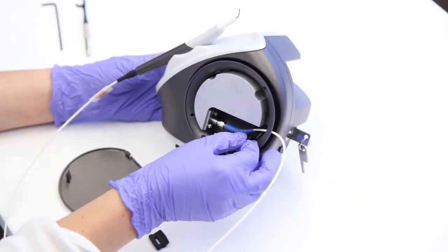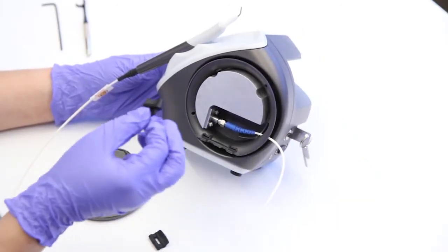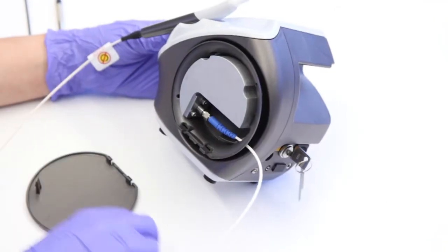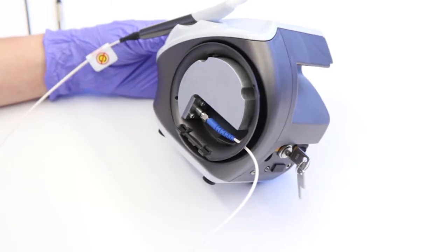First, gently grasp the fiber block and remove it from the unit before disconnecting the fiber. Place the wind cover, wind retainer, and fiber block to the side.